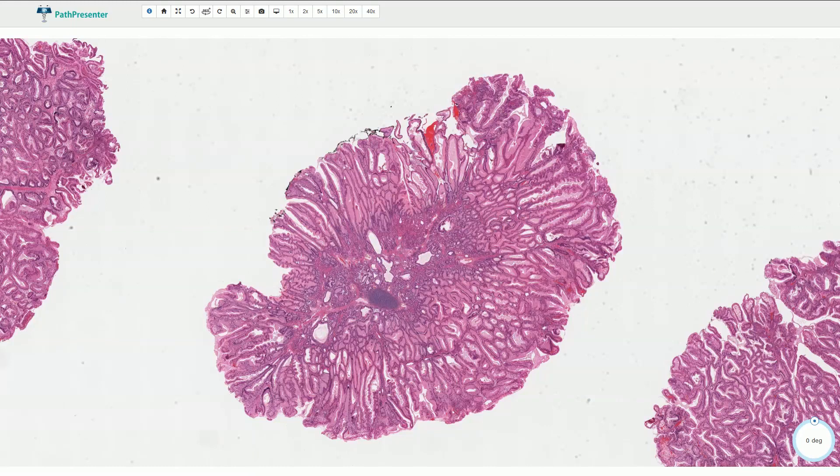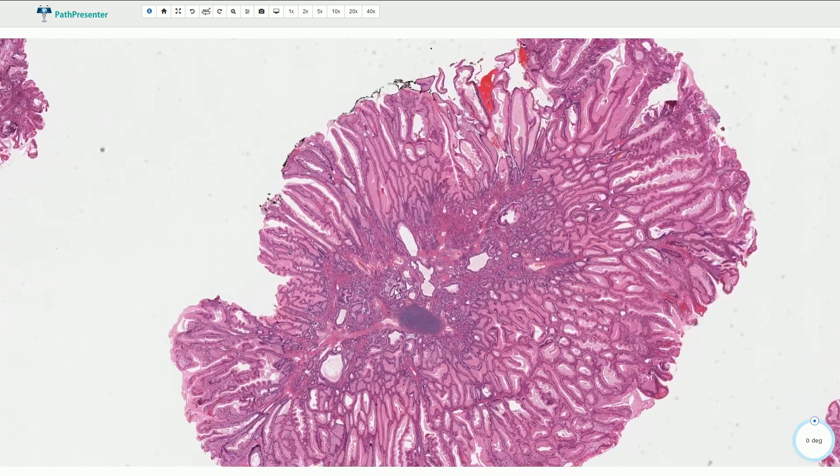This is a histological slide with a Peutz-Jeghers polyp. It is a polyp with a villous papillary surface.